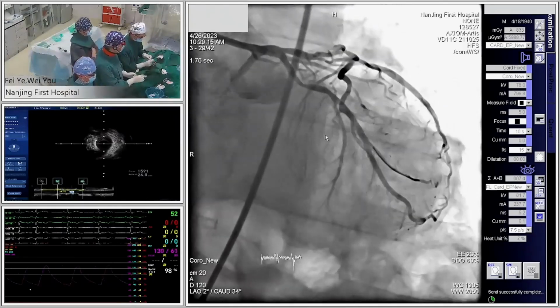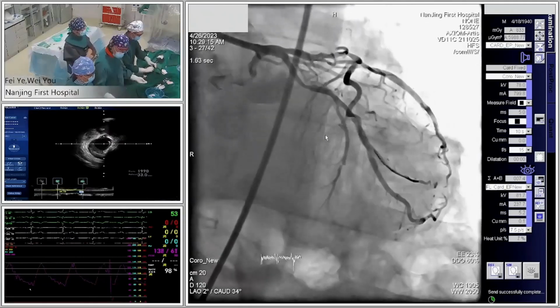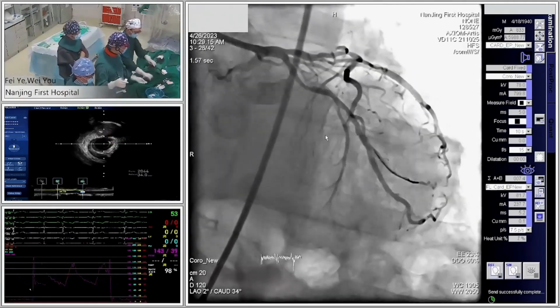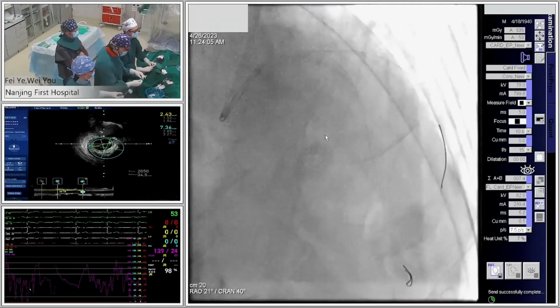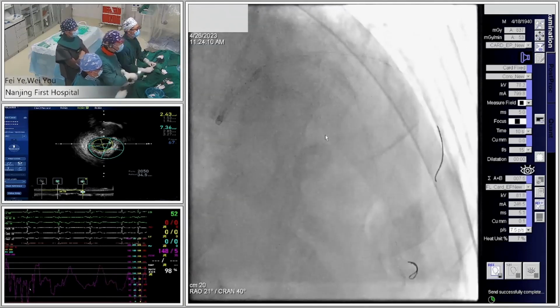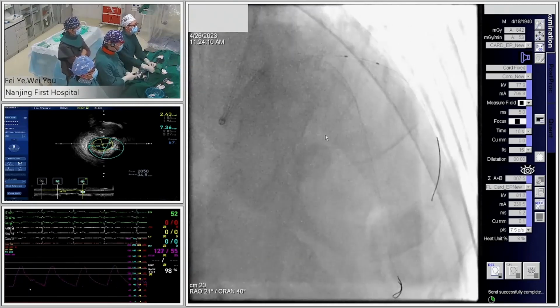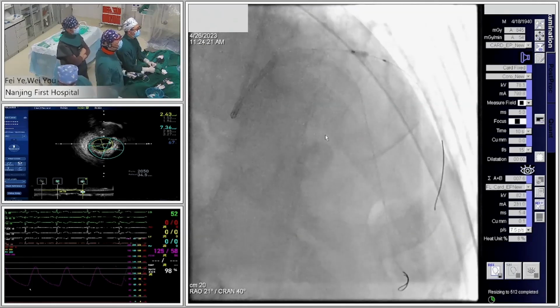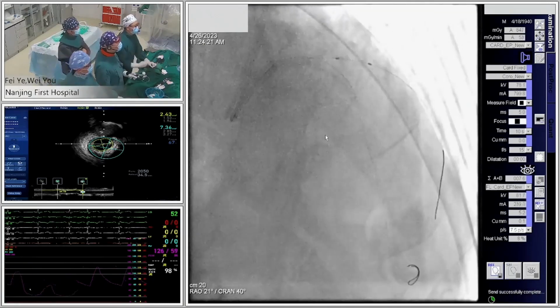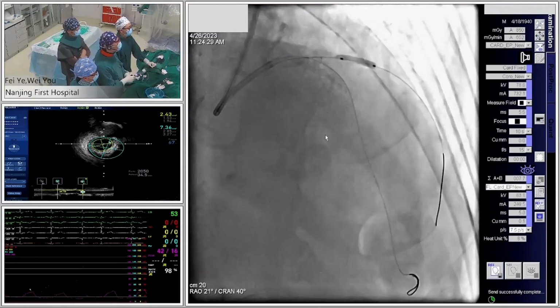This is fibrous. 12 o'clock is the LAD. Yes, based on the IVUS, we can use an NC balloon. Inflate. 6, 8, 10. Slip a little distally. Make sure. This inflation is a 2.75 NC balloon. We can see a little slip at 10, distally.